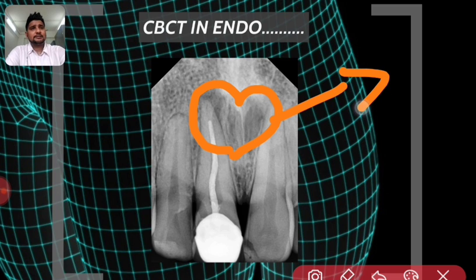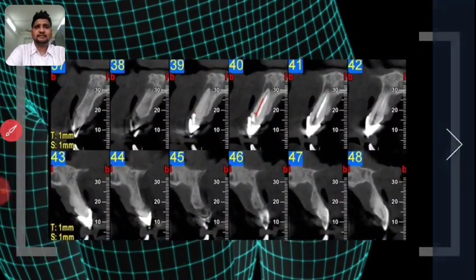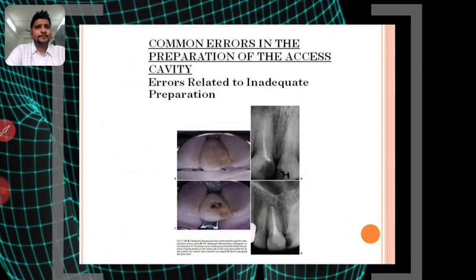Okay, let's just have some fun. All right. So that's where you can advise a CBCT for your endo cases as well. In the West, they are advising it for routine cases, but we know our resources are limited. So if you come across this kind of case, you can go for a CBCT.